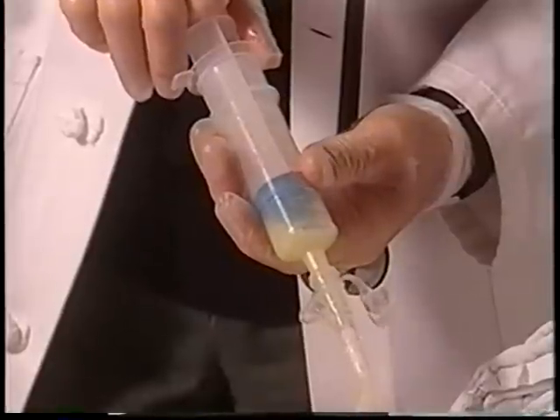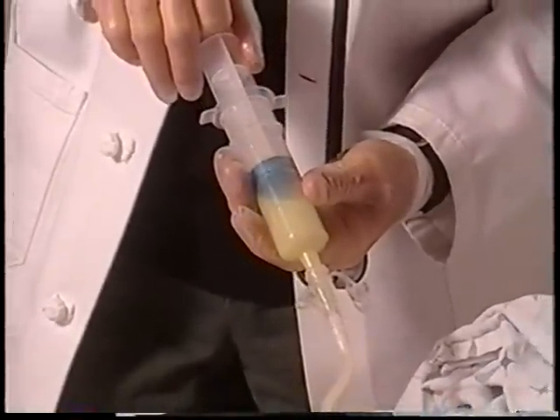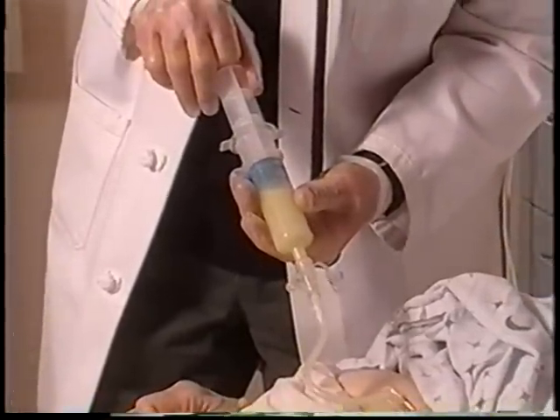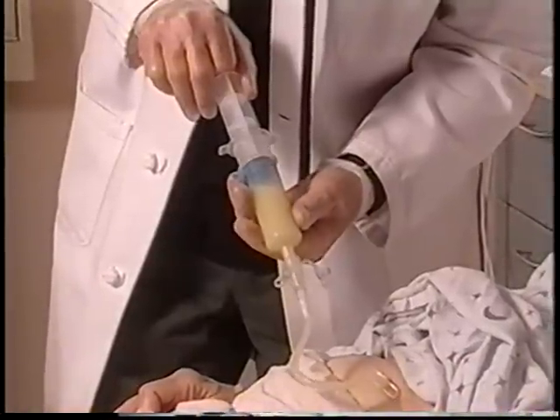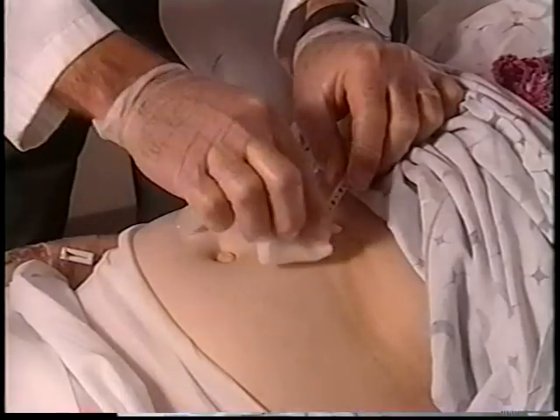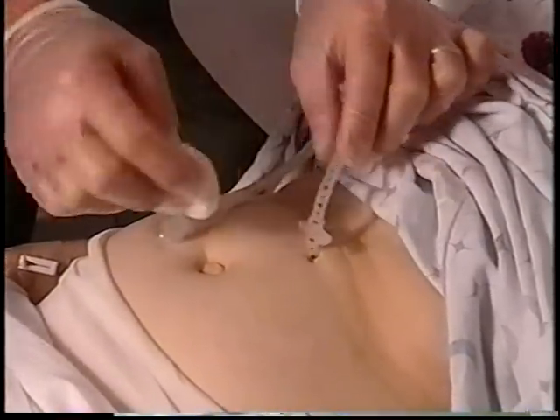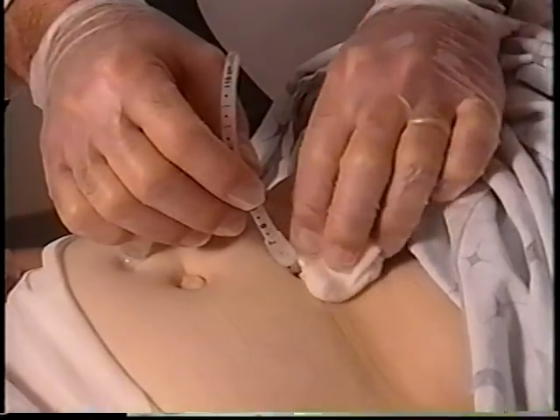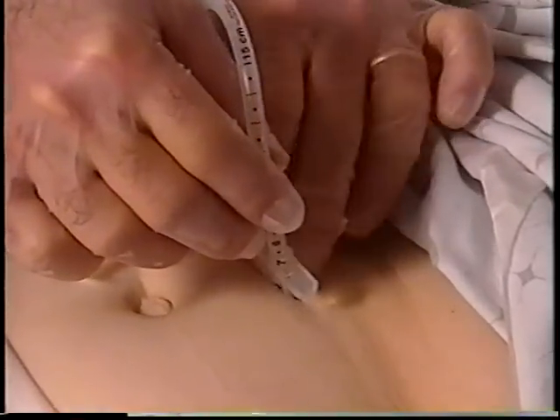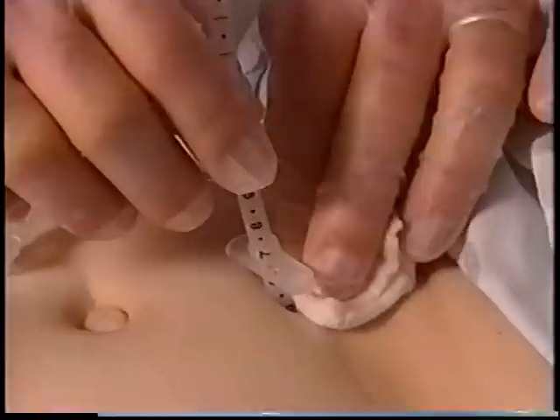A decrease in gastrointestinal tract function or a feeding rate that is too rapid can cause leakage around the tube. An assessment of residuals will reveal if that may be the cause of the leakage. If residuals are high, decompression, a change from bolus to continuous feeding, or a decrease in feeding rate may prevent further leakage. The cause of leakage around the tube must be determined and corrected to avoid skin irritation. To maintain a healthy stoma site, the skin must be kept clean, dry, and free of drainage. To protect the skin from drainage, a waterproof barrier around the site may be used.